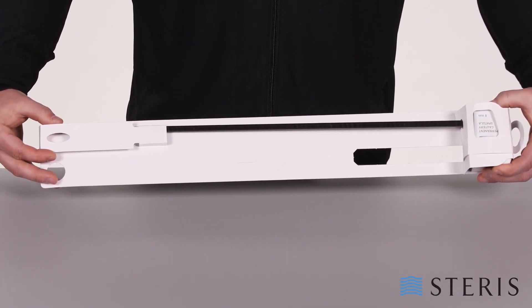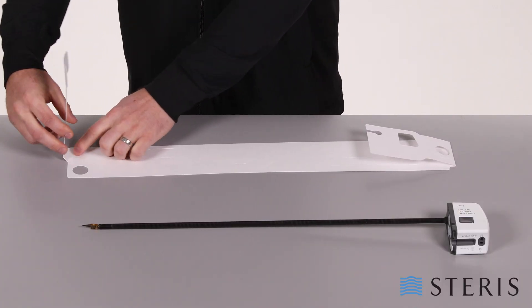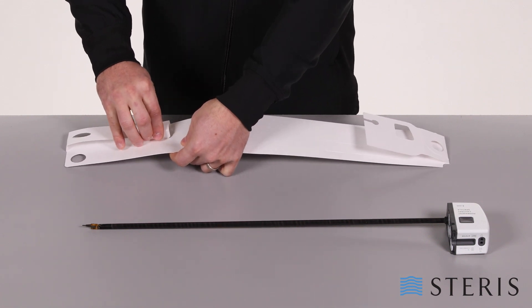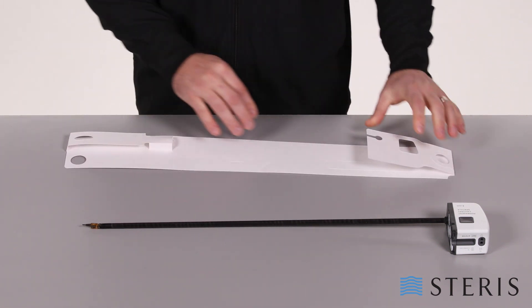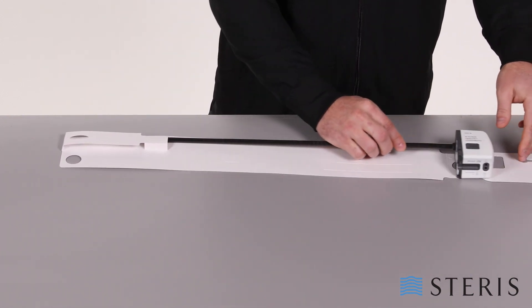For example, here is a completed robotic arm instrument card. The first step to construct the robotic arm instrument card is to create the distal end holder. This is created by folding on the creases to create the end, then fold the two side tabs and insert them through the slit in the base. At this point, you can insert the distal end of your robotic arm into the pocket formed by the distal end holder.